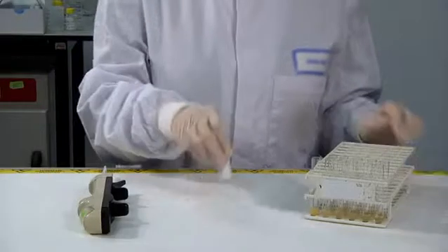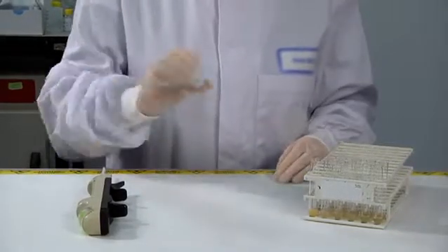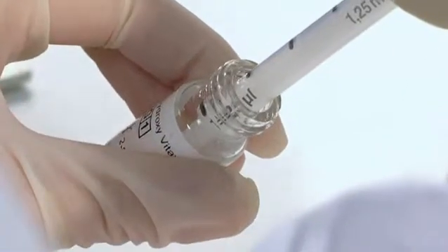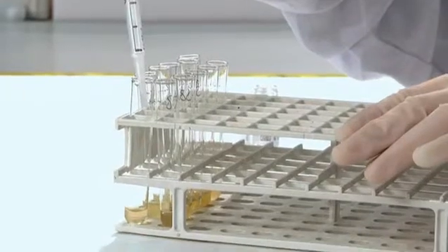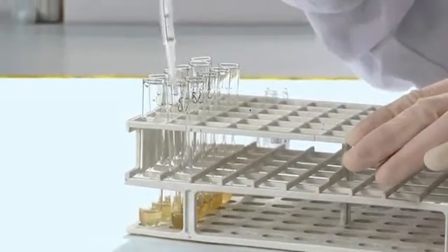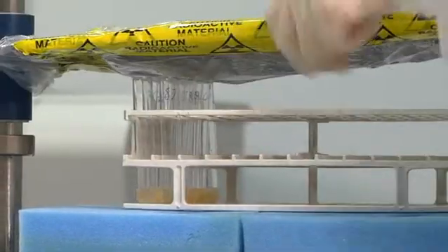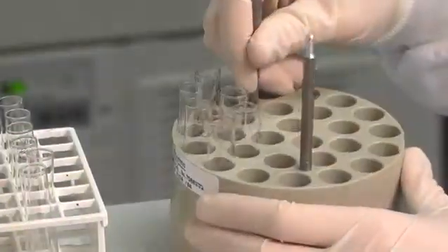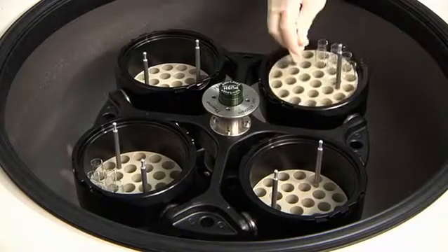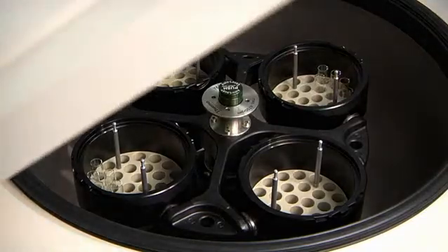Step 3: Add 50 microliters of delipidation reagent to each tube. Vortex all tubes. Step 4: Centrifuge all tubes at 2000G for 30 minutes.